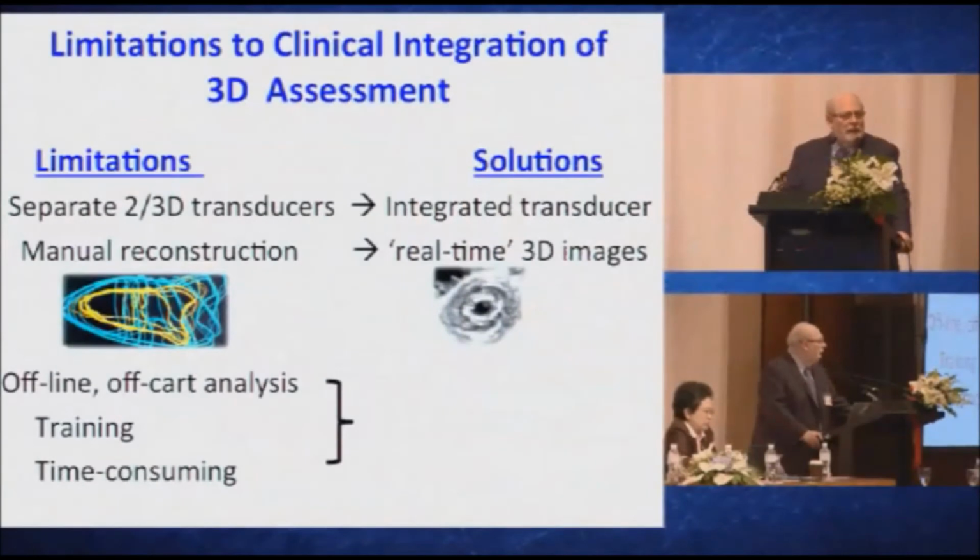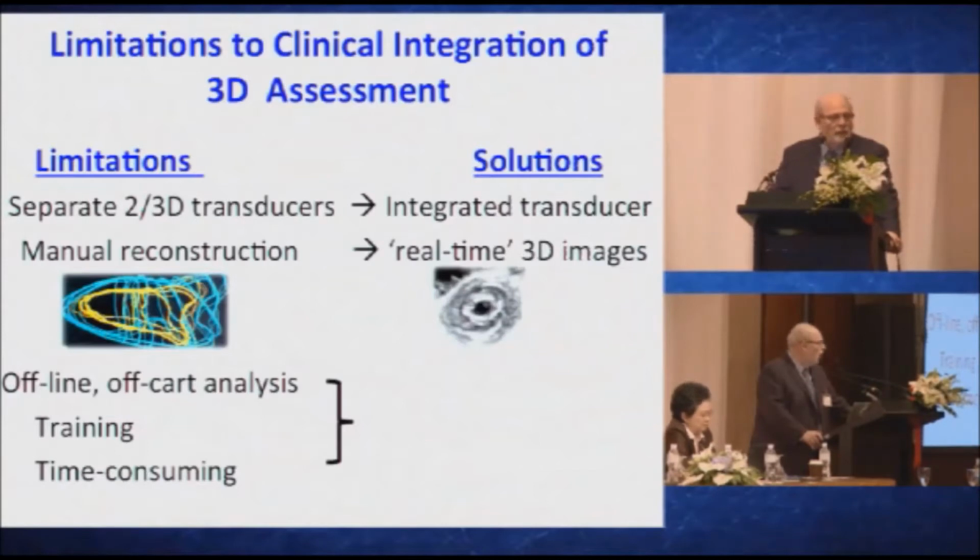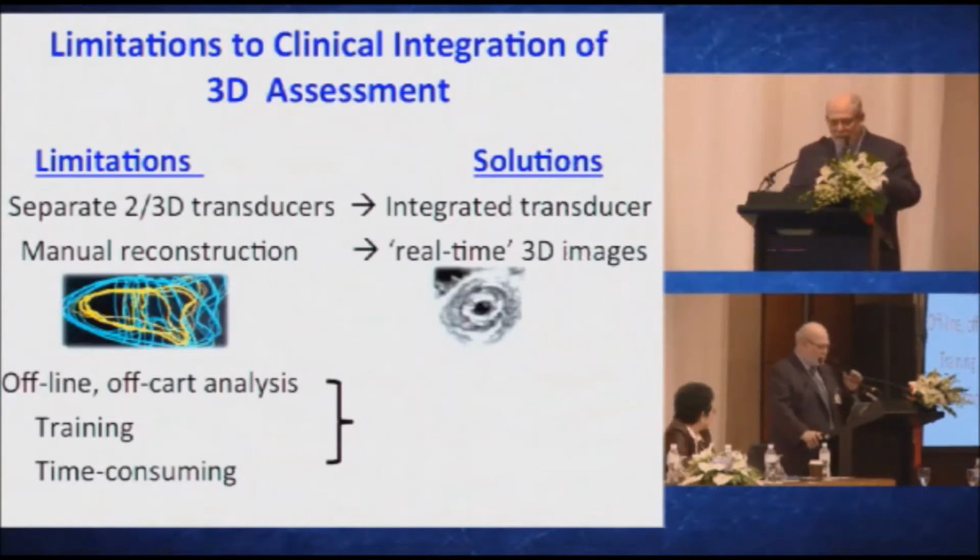Now, when you think about it, I mentioned this in my talk earlier in the morning, 3D echo has not been truly clinically incorporated into the routine of daily practice. And there are many limitations as to why this happens.